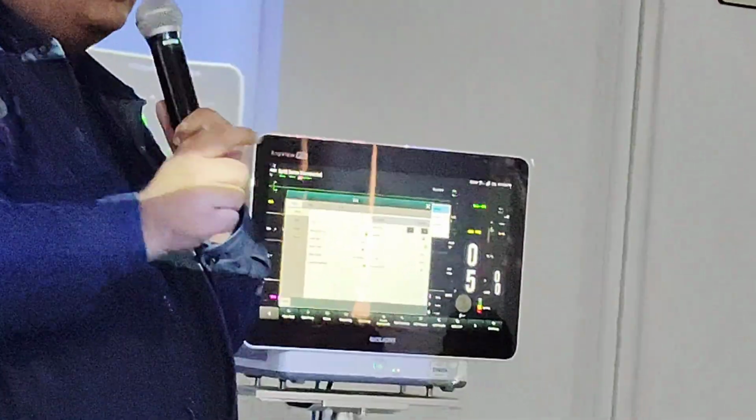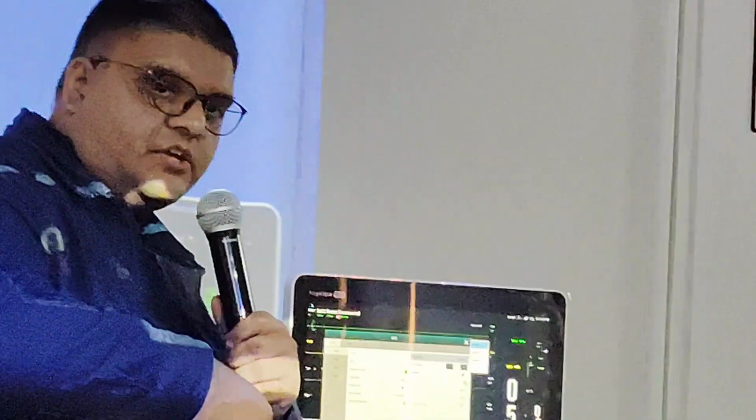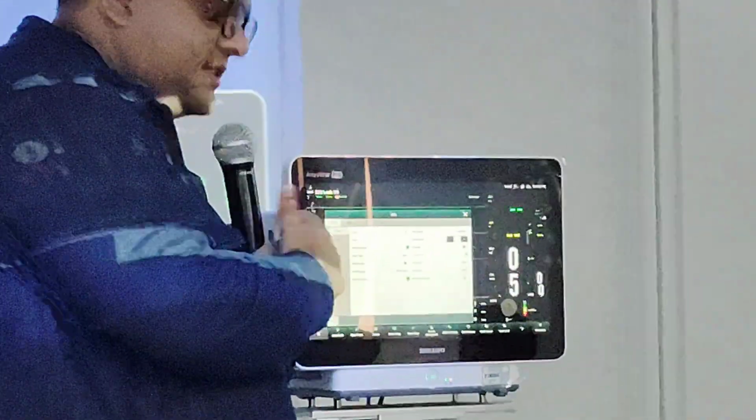In operation mode, there's another advantage. You're using maybe cautery, the electric knife, as it's also called. When you use it, it will filter that out as well. And then we have the ST mode. That's for patients with myocardial infarction. You can use it in ST mode. So use it in monitor and then use the auto lead type.